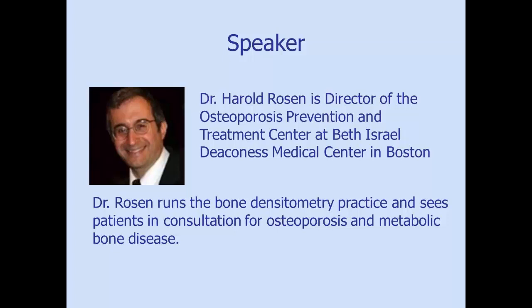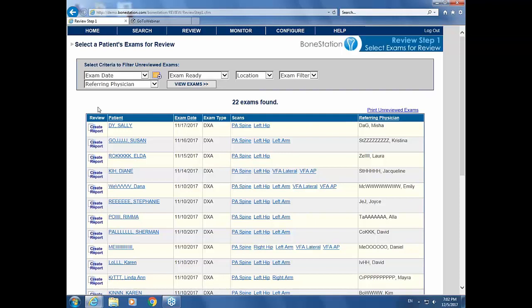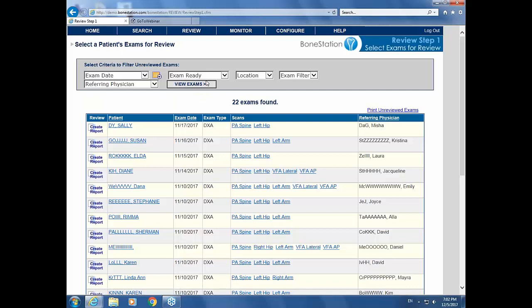Thank you very much, Sylvie. I hope everybody can hear me okay. Thank you all for joining me. I would like to take you through reading a couple of bone densities live. Don't worry, everything is de-identified and there are no HIPAA violations here. We are using software called BoneStation to read the bone densities, and it will allow us to go through all the necessary maneuvers and checking that one needs to do as one reads a bone density.